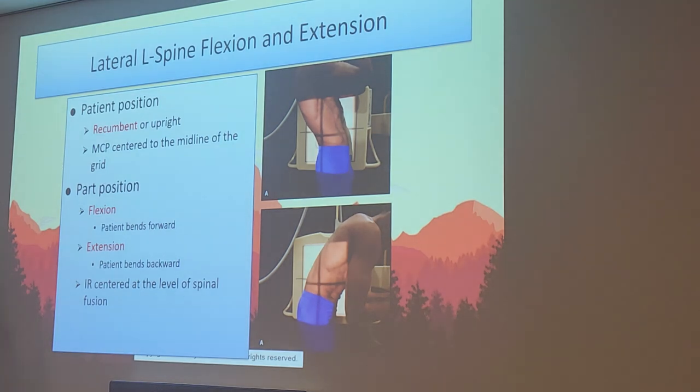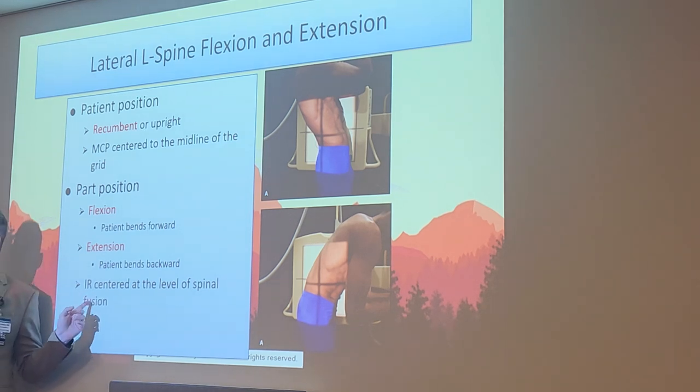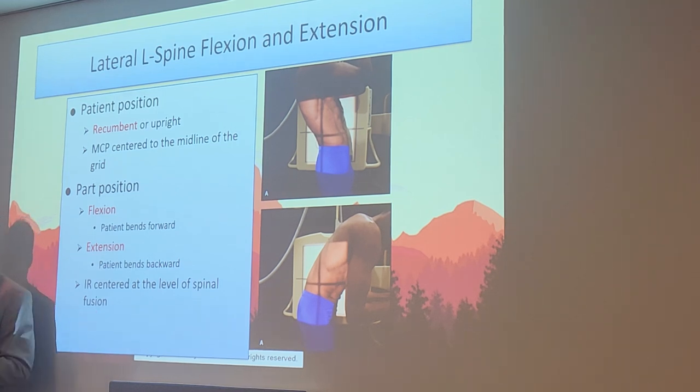So first off, recumbent is superior, even though you see them standing on this one. We've done both ways. Flexion means the patient bends forward, almost like you're flexing a muscle. Patient bends forward for flexion, patient bends backwards for extension. And the IR centering varies depending on where the spinal fusion is. So that's where you have to look at your order and find out where the spinal fusion took place. So you might have to adjust that centering slightly.